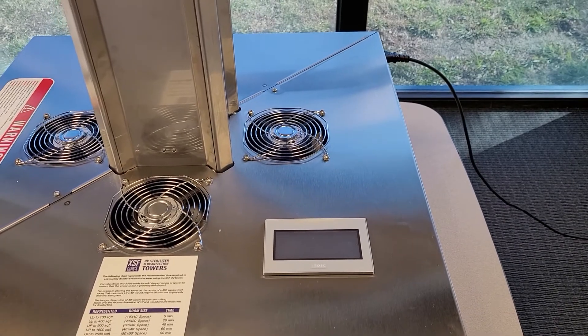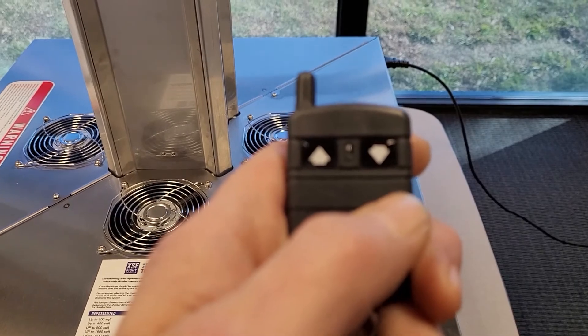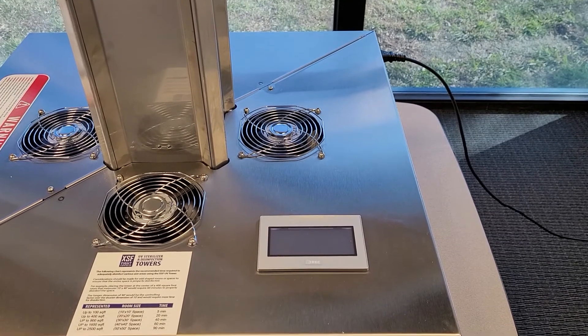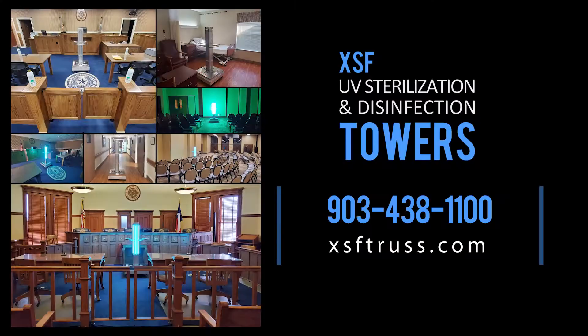Press the down arrow on the wireless remote to power back on or reset the unit. We encourage you to visit www.xsftruss.com. Protect your staff, customers and community.